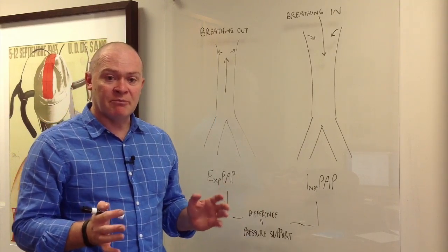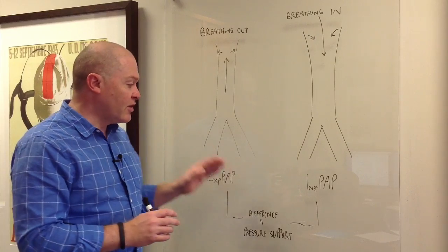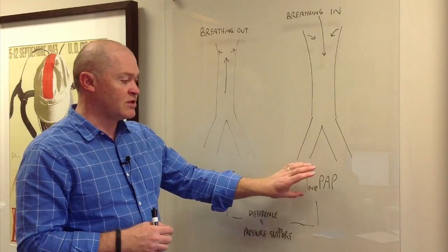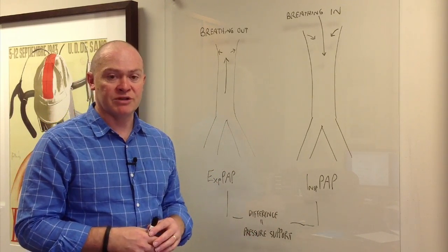So don't be intimidated by the BiPAP Auto, it's actually pretty simple to set the parameters, and try and think of it in this type of framework of what's the minimum expiratory positive airway pressure, what's the maximum IPAP, the minimum pressure support and the maximum pressure support.